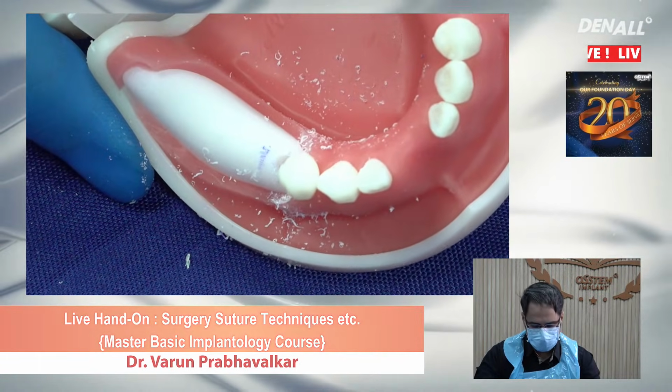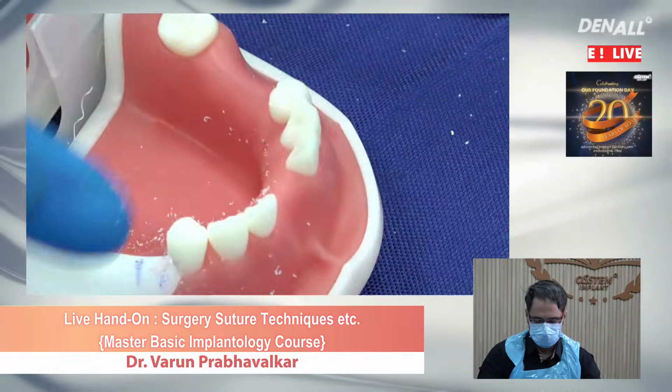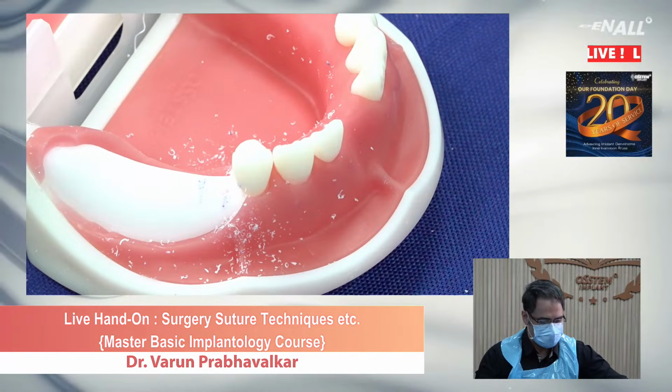There you go. Okay. Going to keep this thing over here.